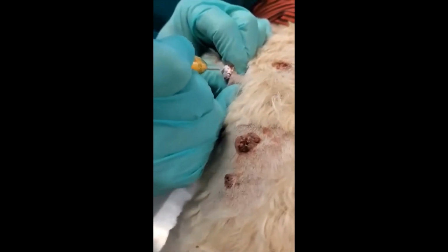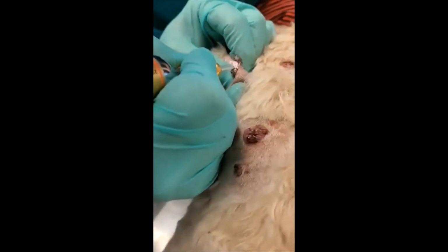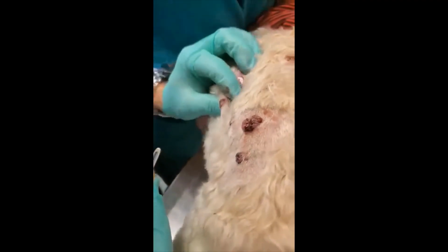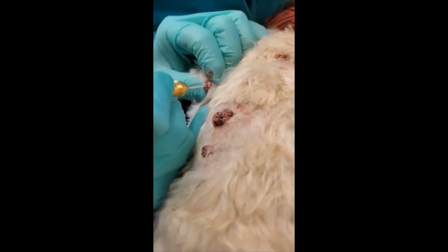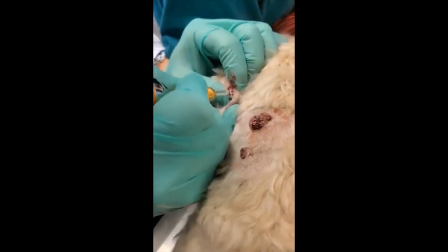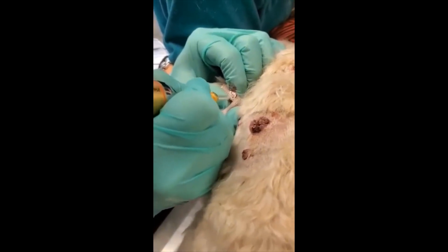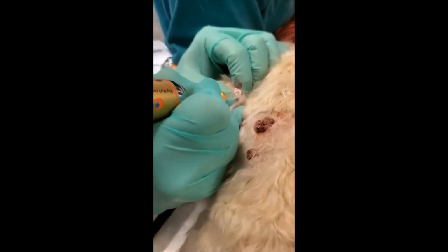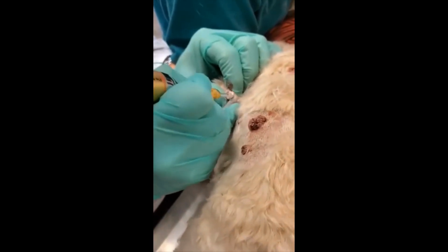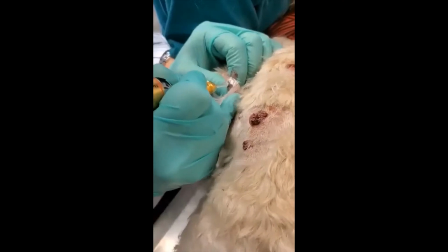Typically, I recheck these in 3 weeks. And if at 3 weeks there's any remaining tissue, I will touch it up at no charge to the client. Overall, response is probably 85 to 90%, and client satisfaction is very high.